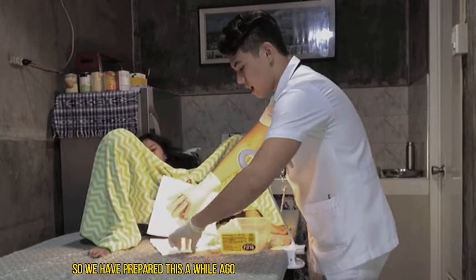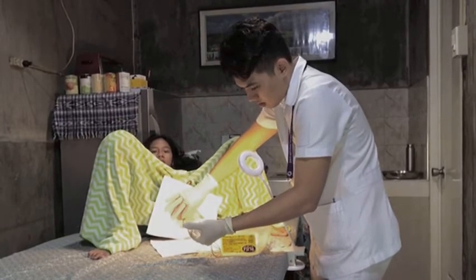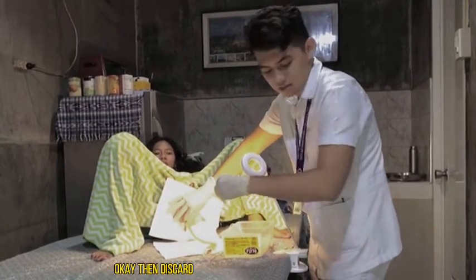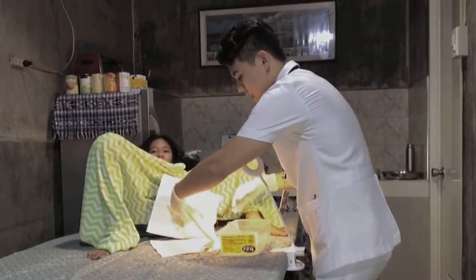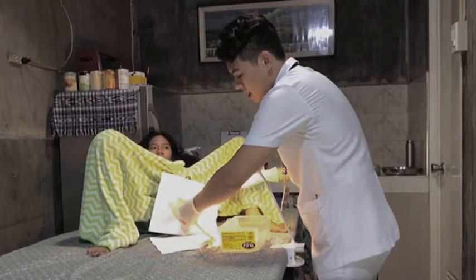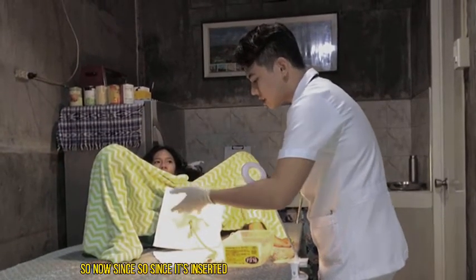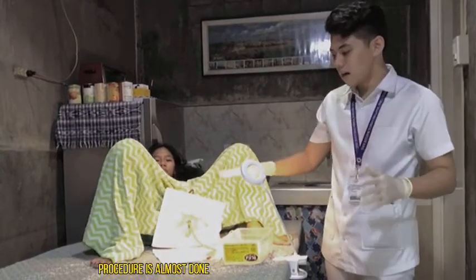Okay, so we have prepared this a while ago, so we will be inserting this one. So, just put it back there. Okay, then discard. So for you to make sure that it's inserted correctly, you can actually pull it out. Then if it tucks in, then your catheter is inserted correctly. So now since it's inserted, our hands can now be unsterile because the procedure is almost done.